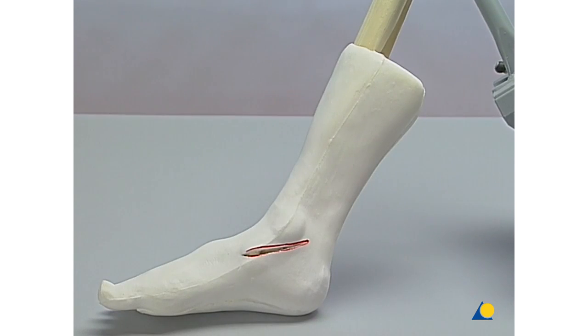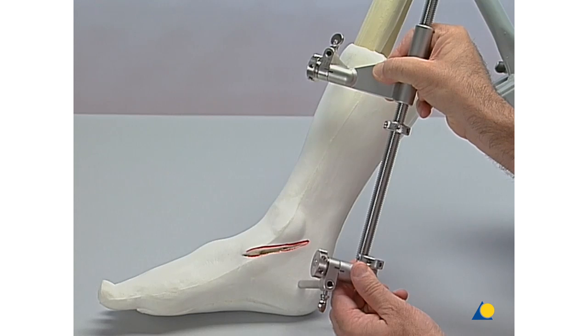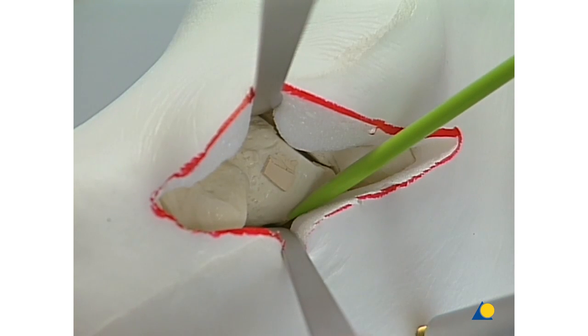A femoral distractor using the long sleeves is placed between the tibia and the calcaneus on the medial aspect of the leg. The aim is to demonstrate the anterior subtalar joint surface.